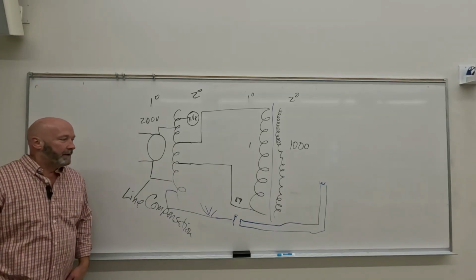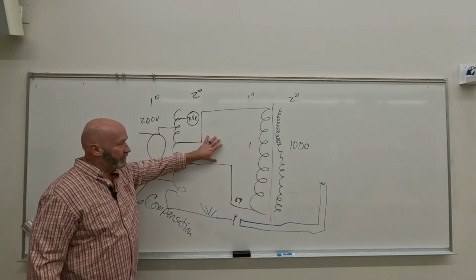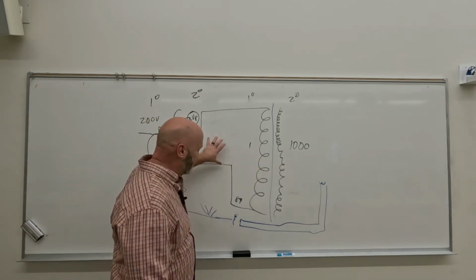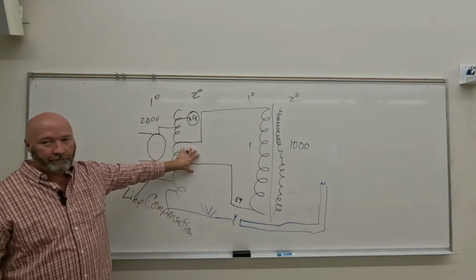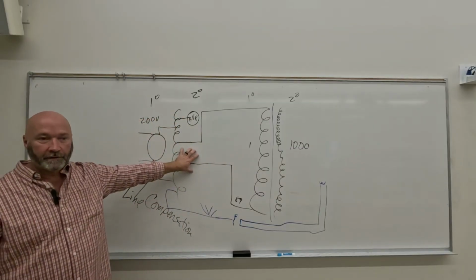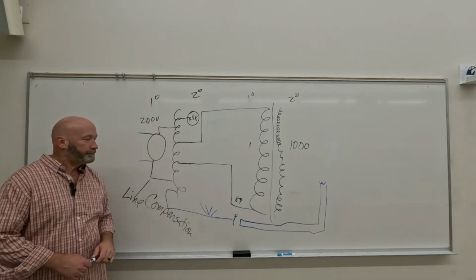I can't do both. All right, so low voltage circuit, filament circuit, high voltage circuit. Everything that we can put over here on the low voltage circuit, we want to put over here on the low voltage circuit, okay? kVp meter being one of them.